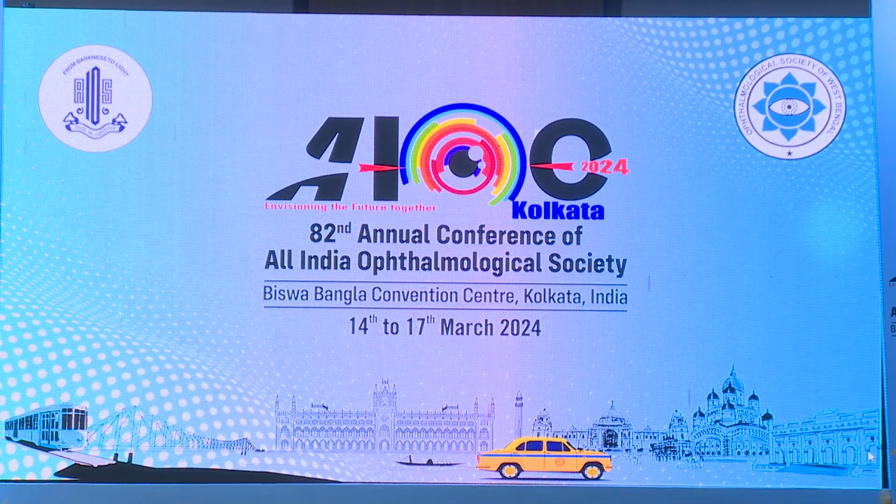Thank you, Dr. Rahul. We really appreciate your presentation because it really explains to us the different kinds of machines. You talked about the Ganzfeld bowl, where you get the flash stimulation. The other is the screen, where you get the stimulation by the screen, and the flashlight for the babies.